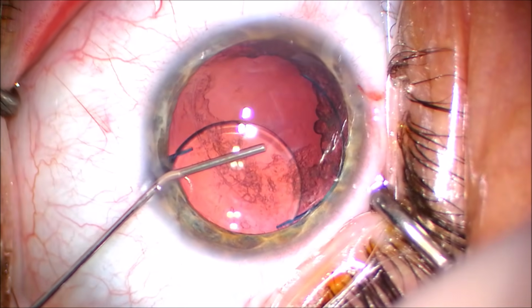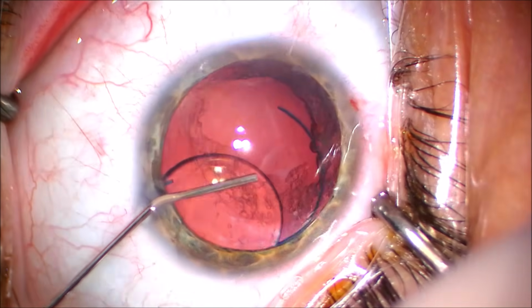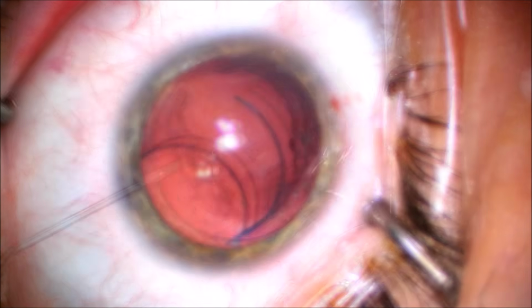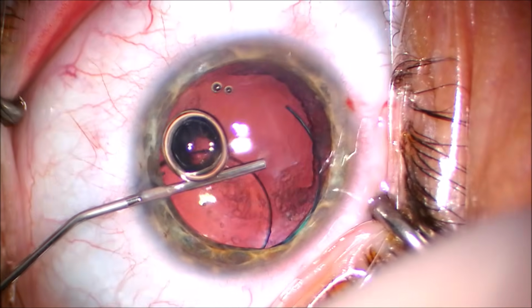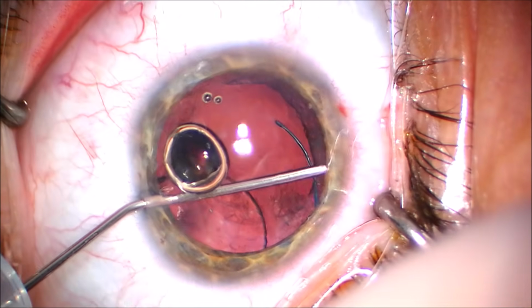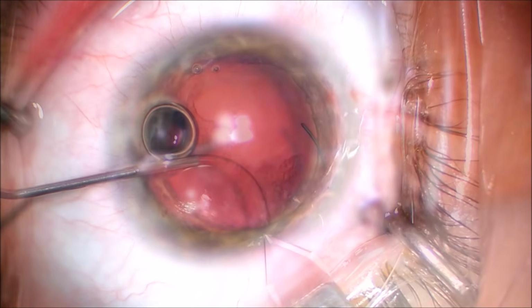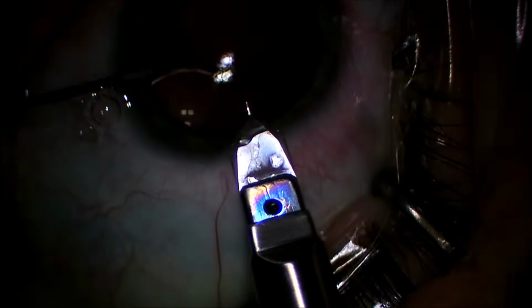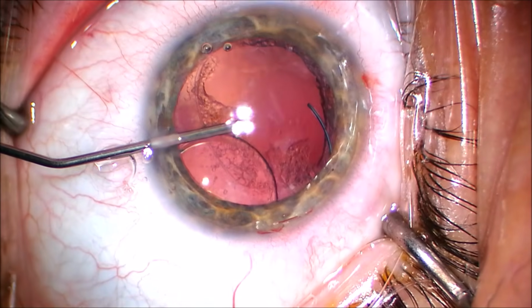And this is when I realized this patient's posterior capsule is intact. And so this patient had cataract surgery. I guess the anterior capsule must have not been intact. So the surgeon just left the patient with a 3-piece lens passively fixated in the ciliary sulcus. So I make my incision. I'm pushing more dispersive viscoelastic. And so I'm thinking to myself, the patient has an intact posterior capsule. Obviously, the anterior capsule has fused to the posterior capsule many years ago.